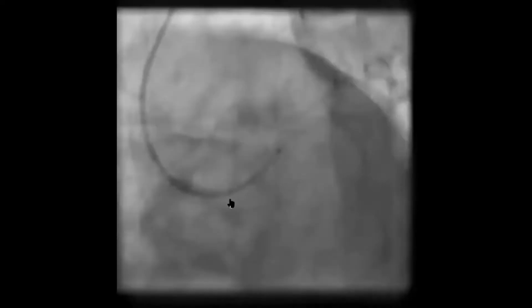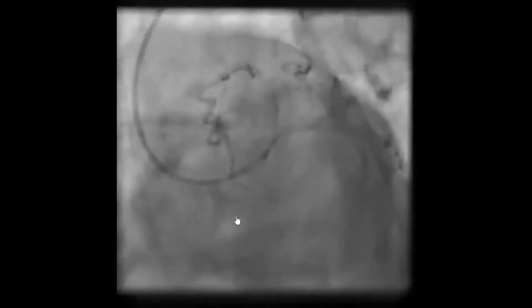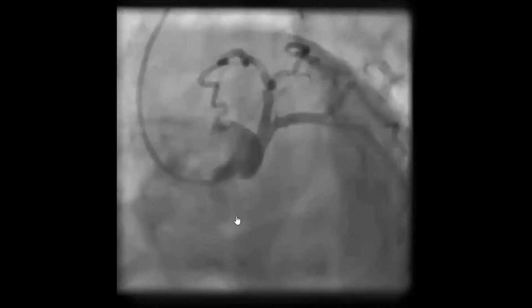So again, you try and see, is there a diaphragm visible? And you look and see there's no diaphragm visible. There's only the heart border here. You can't really see the diaphragm. You can see the respiratory movements, but you can't see the diaphragm. Also, the vessel is bifurcating immediately, and it does look like a spider. So this is an LAO caudal view of the left system.